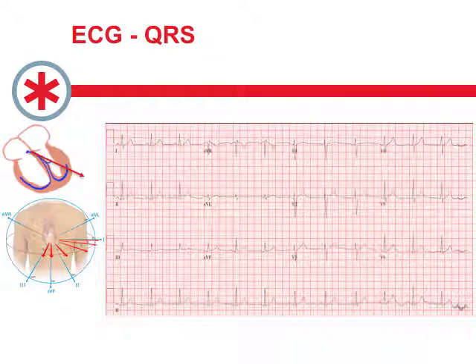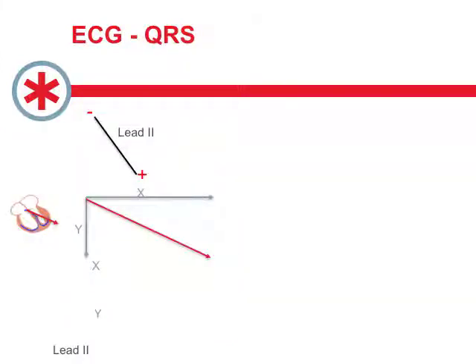All right, so if you need to pause for a moment and wrap your head around that, please do, but I'm going to get you to try and work this out on your own and answer a question that will show if you really got this. So here is a relatively normal ECG, and I want you to look at lead 2 and lead 3. In the ECG, both of them are upright, but lead 2 is quite a bit larger than lead 3, meaning the QRS complex is quite a bit larger in an upright direction than lead 3. I want you to pause this video for a moment, take a pen and paper, and see if you can figure out why that's the case using the same steps we just did. So I'm going to hold on for a moment here, give you a pause, and let you try and work through that. All right, let's walk through this a bit.